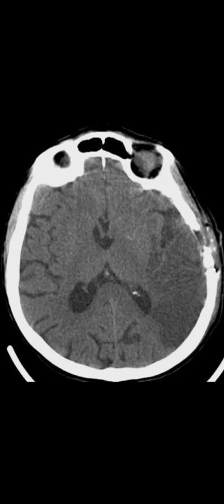I proceeded to make a gently curving incision beginning in front of the left ear at the level of the zygoma and coming up anteriorly to the hairline. The operating microscope was brought into the field, and the root of the left superficial temporal artery was identified. The anterior branch was much larger than the parietal branch. I carefully dissected out a long length of the anterior branch without difficulty. Small side branches were coagulated and divided.